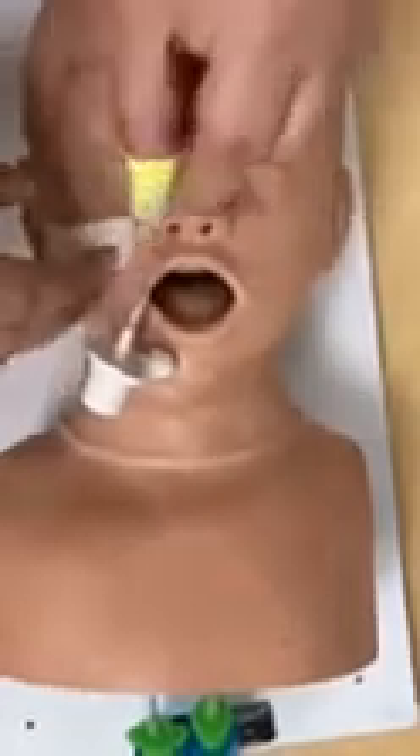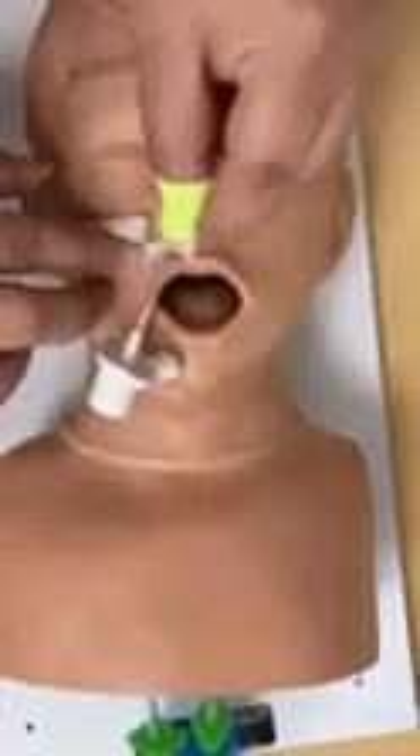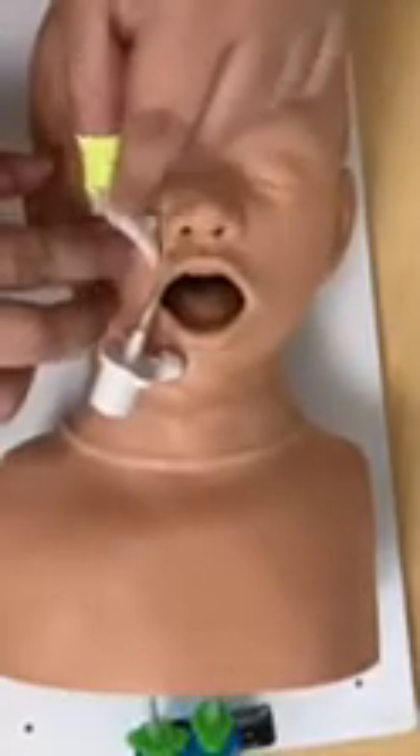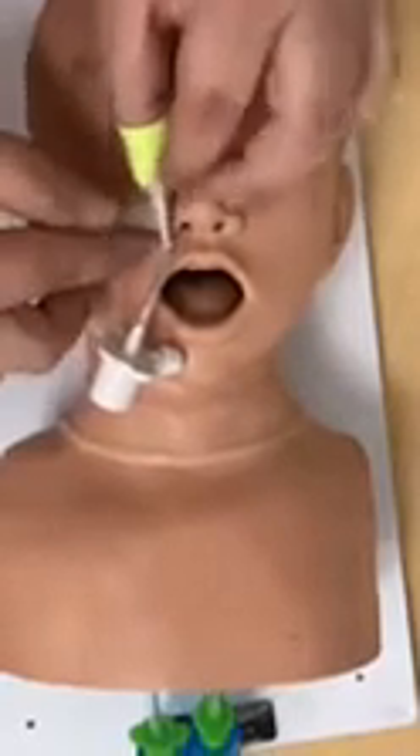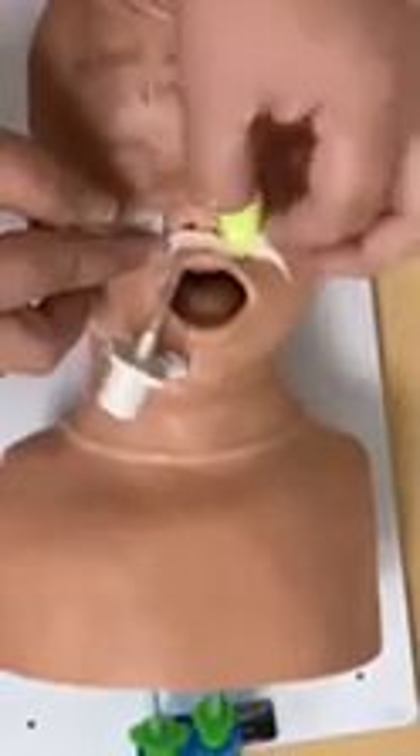Before you get to the tube, it's important to make sure that you're making contact with the face the entire way up until you get to the nare. Your first contact with the ET tube is going to be on top, and then just like an oral tube, you're going to stretch tape, stretch tape. We have a little tab to make it easy to remove if needed.